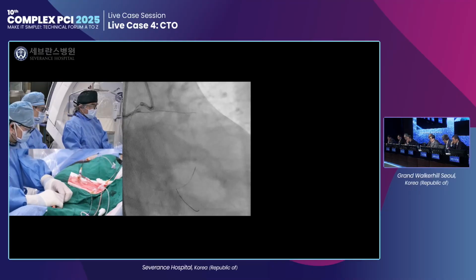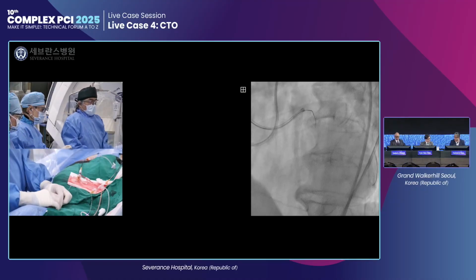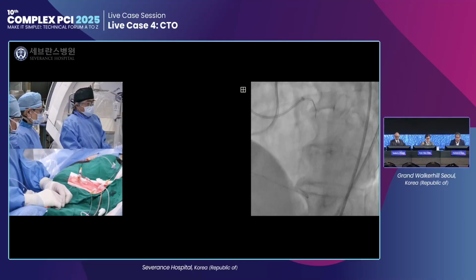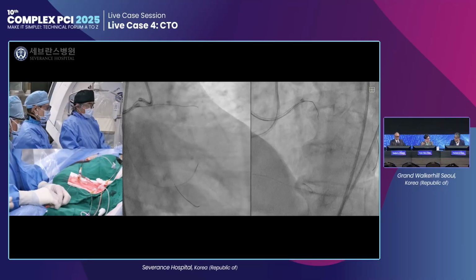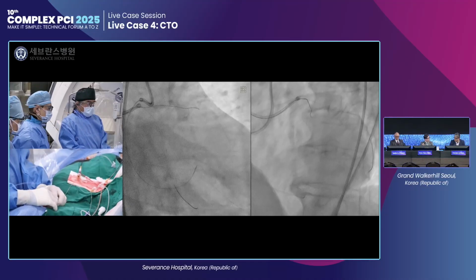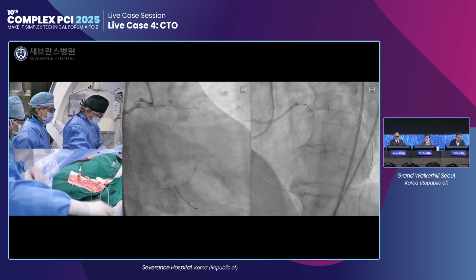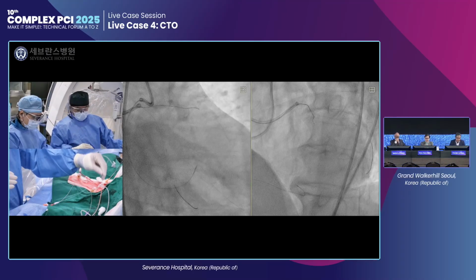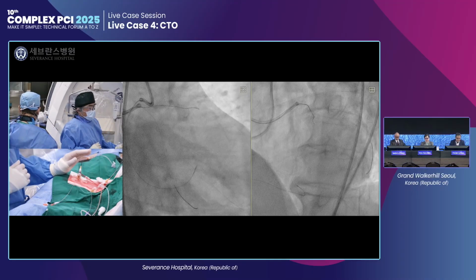But Dr. Hamazaki's opinion is kind of reasonable, because in my experience, if we just lost the retro microcatheter inside a microchannel, it is easy to reintroduce. Thus, there are some formed, dilated channels created by introduction and retrieval of the microcatheter.